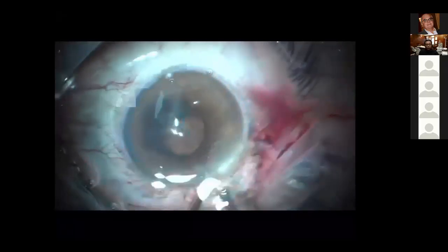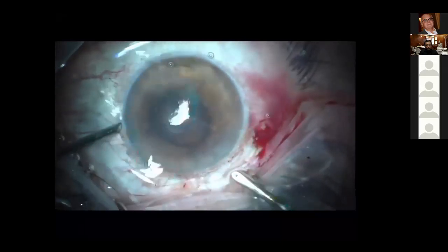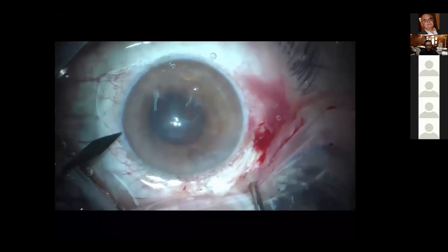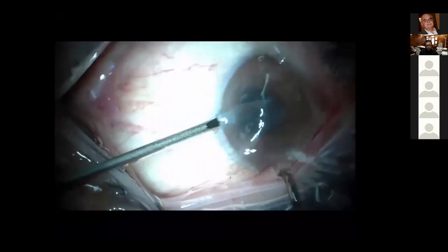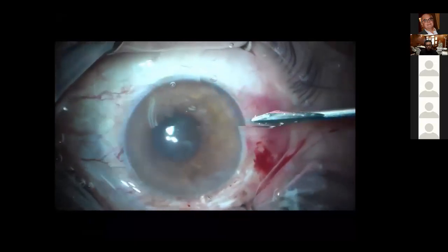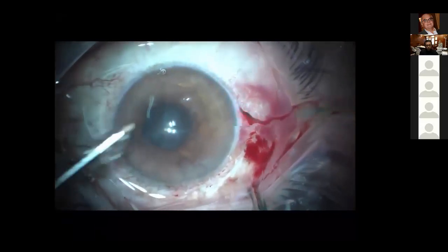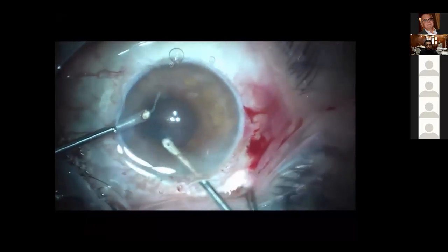Dr. Sherif, I see in the timeline, you are a phaco surgeon that finishes in 5 minutes. This is taking like 13 minutes. Why would you choose to do this? Actually, the phaco snare, when you do it manually at the operating theater, it takes some time to fix it. And this is actually what took the time, not the actual surgery by itself.